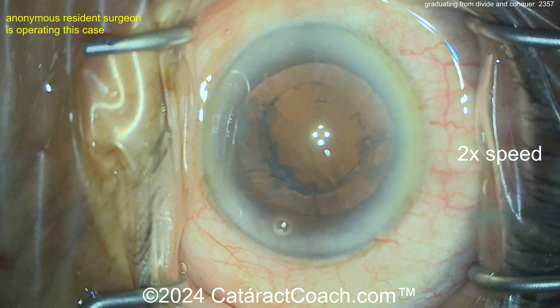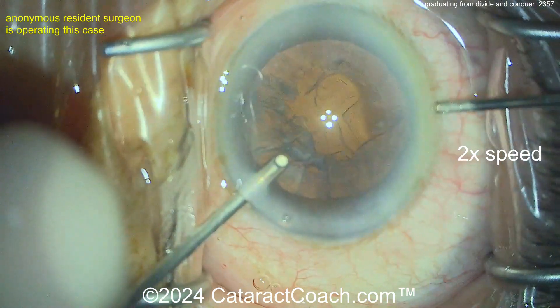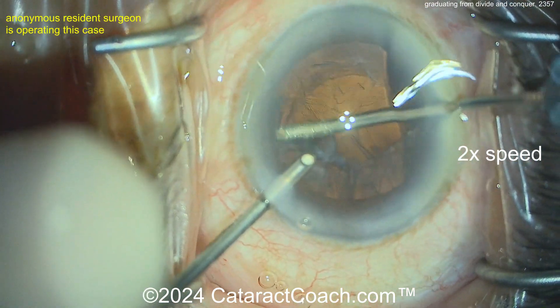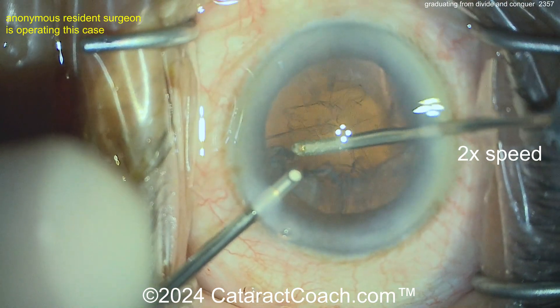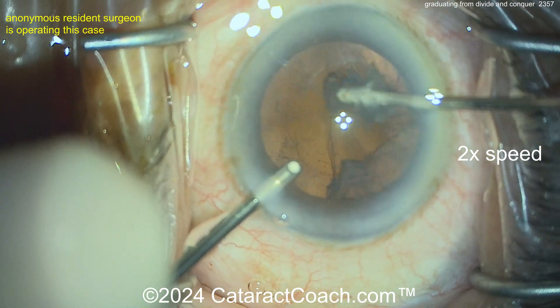Nothing rehearsed here. You may also notice that anytime I do a voiceover, it's one take — there's no editing in the audio track ever, well, almost ever. So here we go — manual cortex removal with the I/A probe. That was a nice-looking nucleus removal.